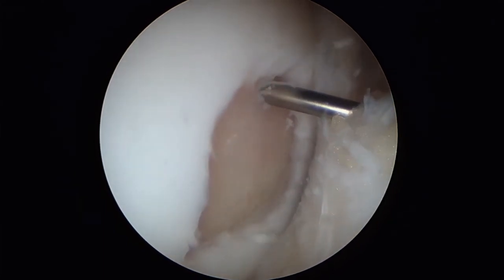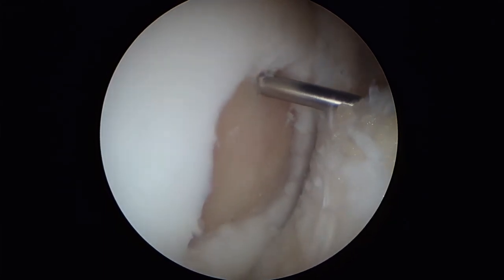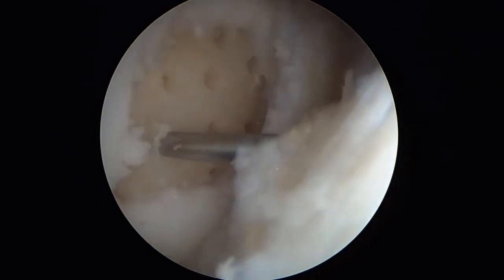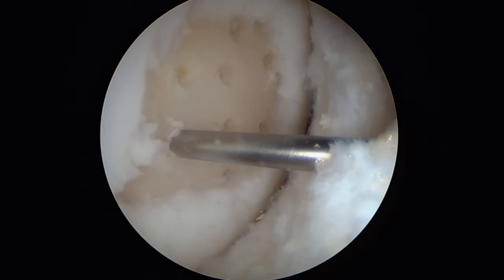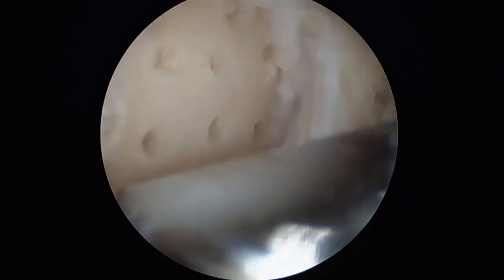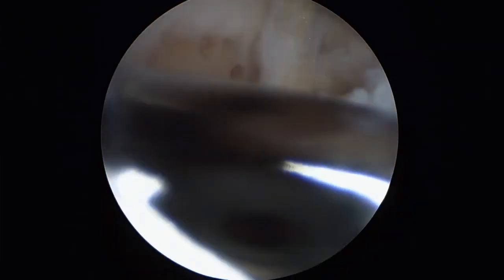A 1.2 mm K-wire is used to create multiple drill holes to give bone marrow stem cells access to the lesion. The defect is cleaned up from unstable cartilage fragments and mechanical irritants are taken away with a shaver.